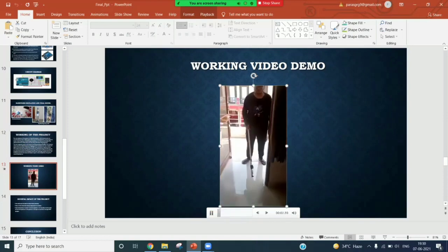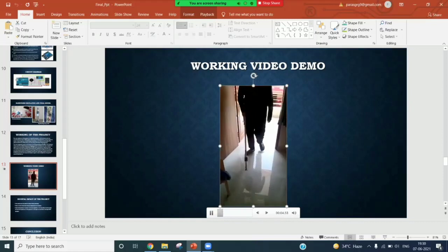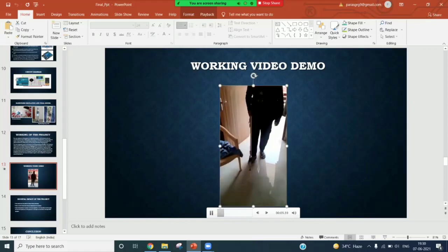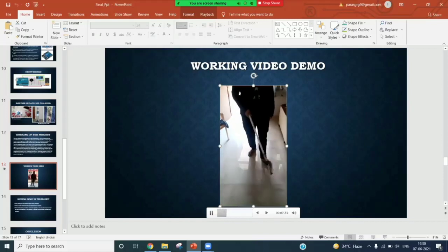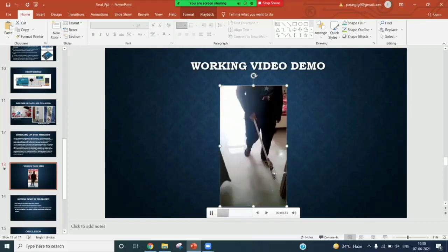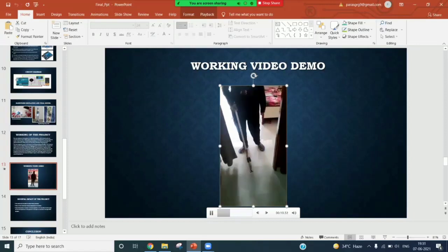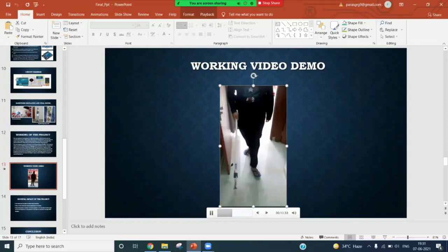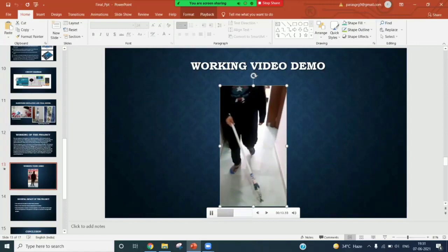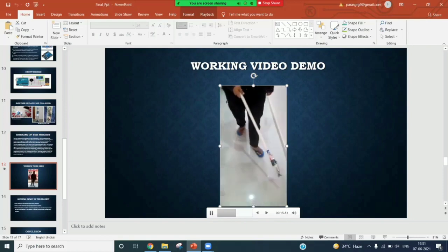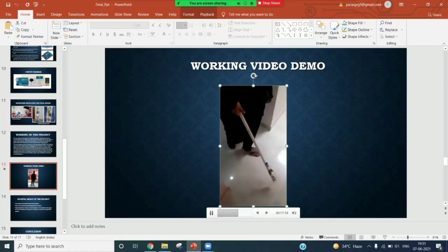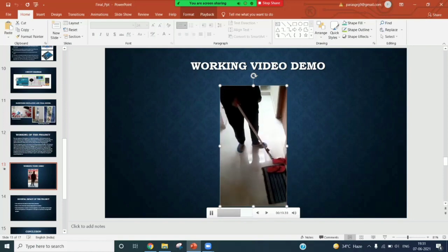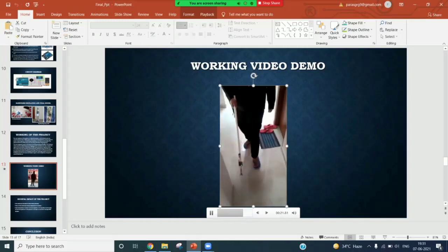As you can see, I'm holding the stick. Whenever I put the stick in front of an obstacle, it produces a beep sound and an LED glows. This is really helpful for visually impaired people as they can work freely and with confidence all around on their own without asking anyone else for help.